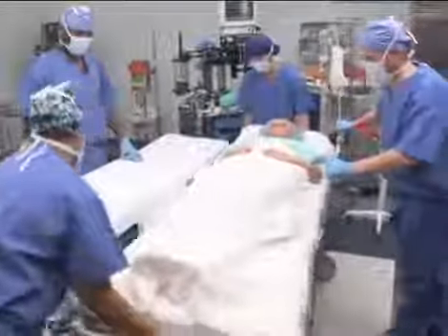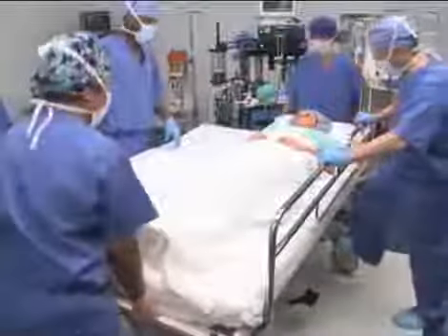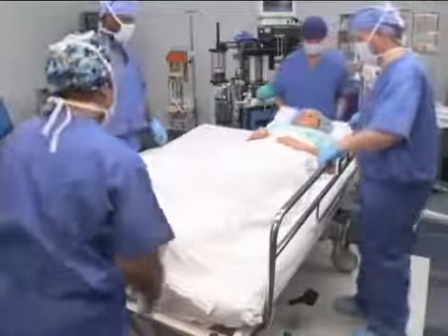Diagnostic and operating room tables are narrow. Transfer vehicles, such as stretchers, if they are not locked, can slip unexpectedly. It is the surgical team's responsibility to perform safe transfer, protecting the patient against injury during surgery.